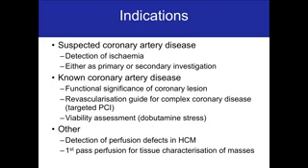If you want to further specify how likely they are going to recover following a revascularization procedure, for example, a coronary artery bypass graft or a PCI, then there is some suggestion that adding a low-dose dobutamine CMR protocol and assessing whether there's some functional reserve in these segments will guide the viability assessment and have some incremental diagnostic accuracy for viability over and above the late gadolinium alone.